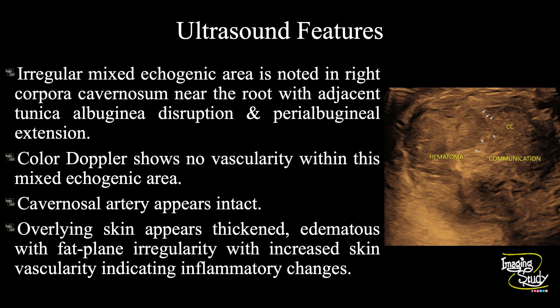In summary, an irregular mixed echogenic area is noted in the right corpora cavernosa near the penile root with adjacent tunica albuginea disruption and peri-albugineal extension. Color Doppler shows no vascularity within this mixed echogenic area. The right cavernosal artery appears intact. The overlying skin appears thickened and edematous with fat plane irregularity and increased skin vascularity, indicating an inflammatory process. Overall, these features conclude this as a case of grade 2 penile fracture.